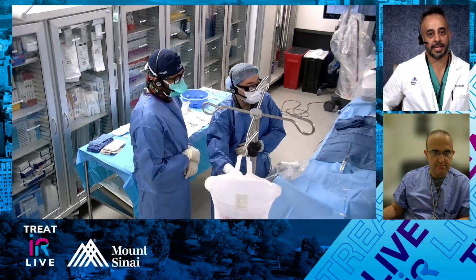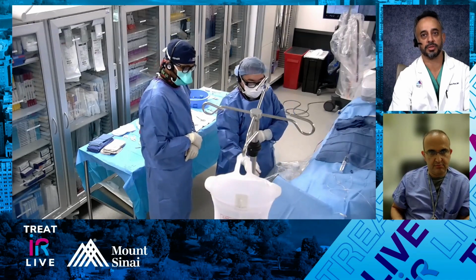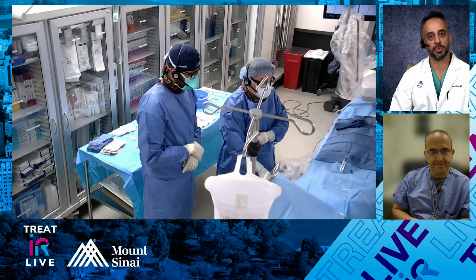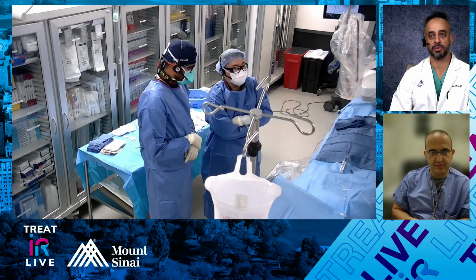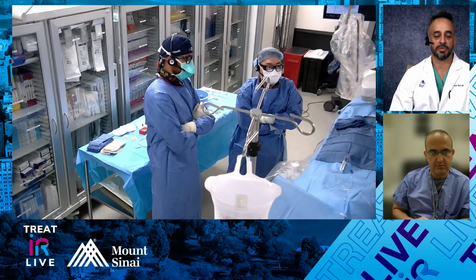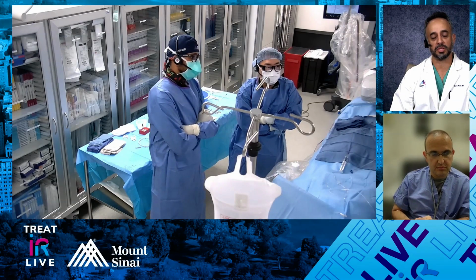Yeah, so classic teaching for splenic artery aneurysms, right, is around 2 to 2.5 centimeters in terms of treatment. But in these patients who are portal hypertensive or obviously pregnancy or childbearing age, we sort of lower that limit. So how do you counsel these patients? And in terms of also this one's a little bit more distal, I think, than some of the other ones. So how did you counsel this patient?